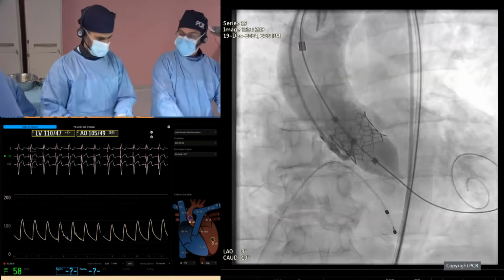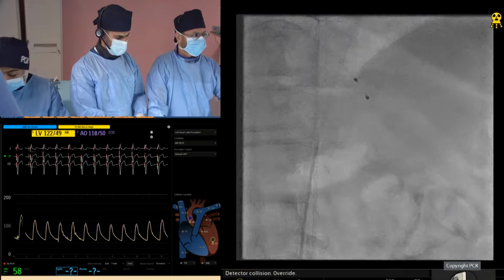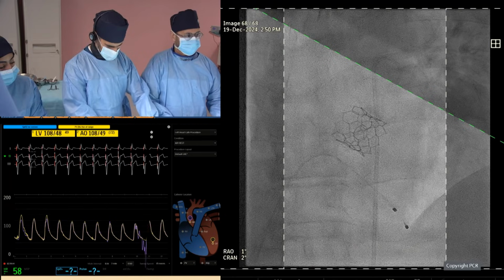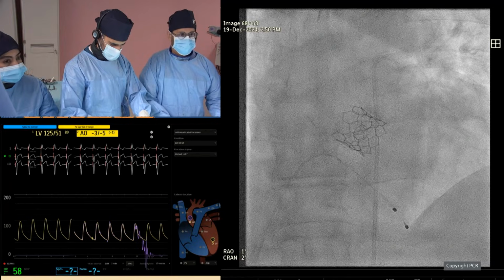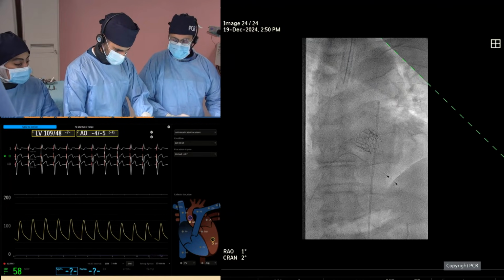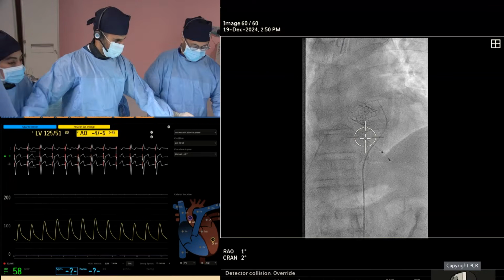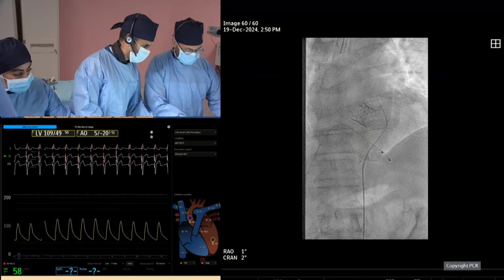But if the sinus is small and the coronaries are relatively borderline or low, probably we prefer to push the implantation down, because the pacemaker is a therapy, it is not a complication. And the patient is at risk by any means. It's atrial fibrillation or right bundle. He's at risk. 80 years, he may need a pacemaker with or without our valve. So we are treating the pathology, and the conduction abnormality probably is a pathology which requires treatment. But checking the coronaries routinely for acceptable anatomy and reasonable future access with the balloon expandable is not usually difficult.